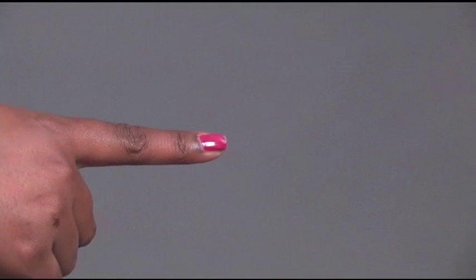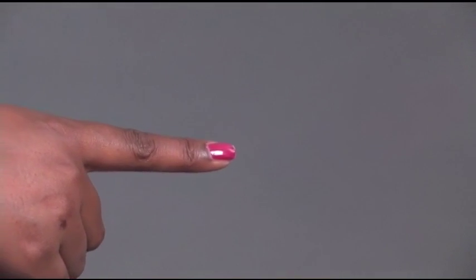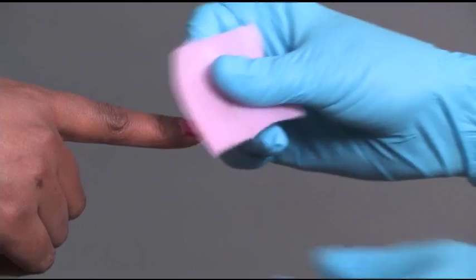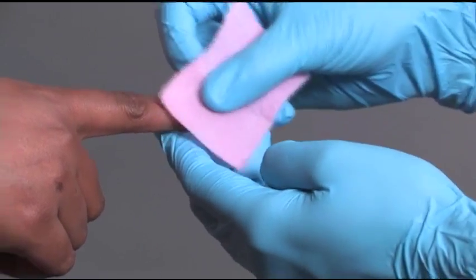Fingernail polish will interfere with pulse oximeter measurement due to color differences. Acetone wipes should be stored with the pulse oximeter and used before attaching the sensor probe.